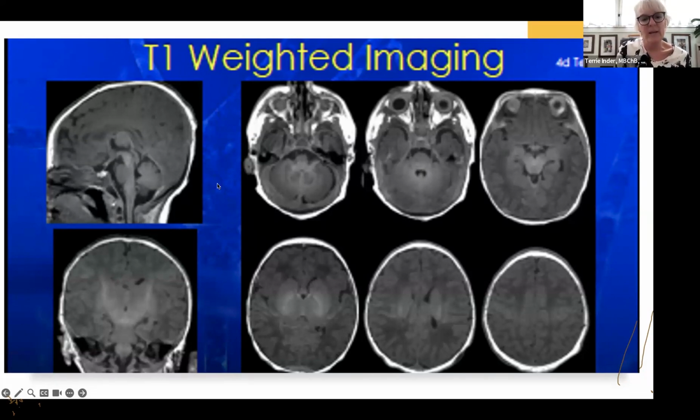So each of these imaging types will usually have somewhere between 60 to up to 120 or more images per type of sequence. So you can imagine just for the T1 alone, if you have a sagittal, coronal, and axial acquisition in your library, that will be 3 lots that you would see up the top, all T1, but that may account for hundreds of images.